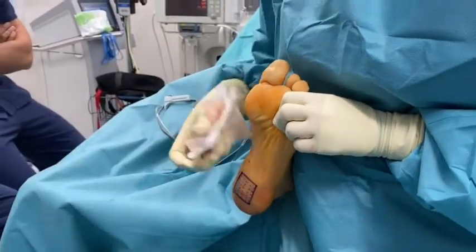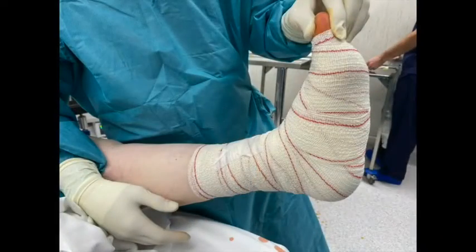Postoperatively, a soft ankle bandage is applied and weight bearing, as tolerated, is allowed two days after.